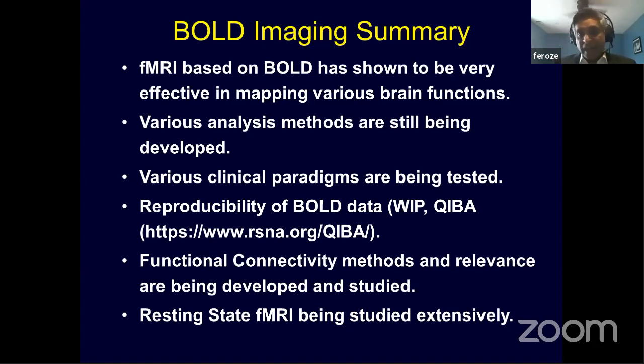If you want to practice this, you can download it and use it. And there are various groups studying the reproducibility of the BOLD data, and it's still a work in progress. And the functional connectivity methods are being studied and developed, and of course, resting state is being studied extensively, right?